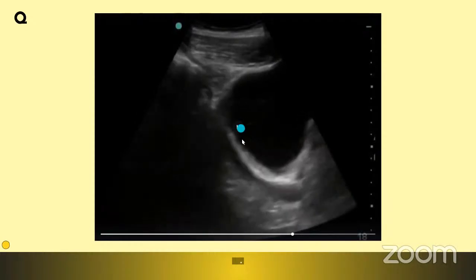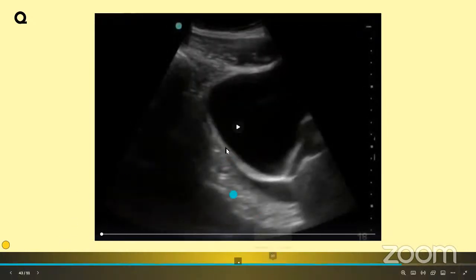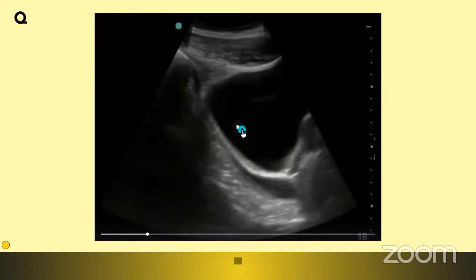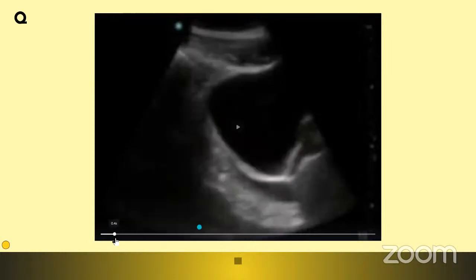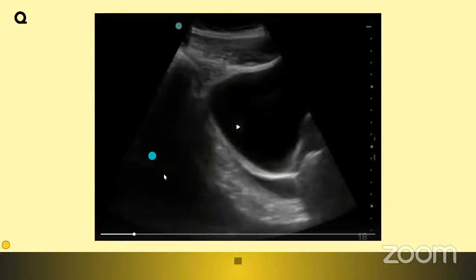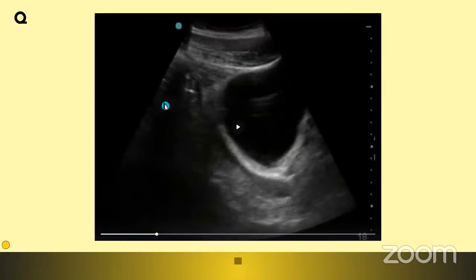Yeah, this is quite hard to find. Okay, just by seeing it, and with the normal images which we discussed before, we can say that this is a urinary bladder. This is the pelvic examination in the eFAST, the fourth component. The orientation marker is towards the cephalad direction, towards the head, and this is superficial. This is deep. This is the urinary bladder. So here there must be rectum. Since the rectum would also have air in it, we can very well get shadowing.